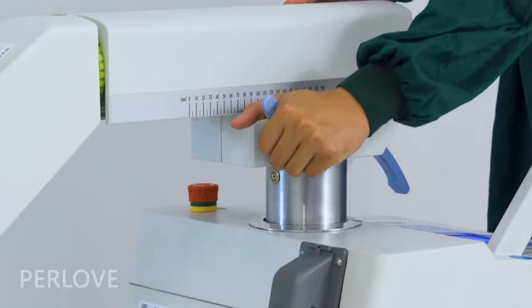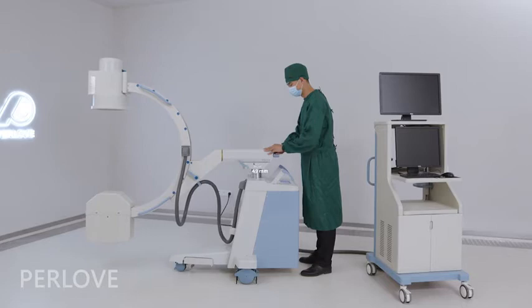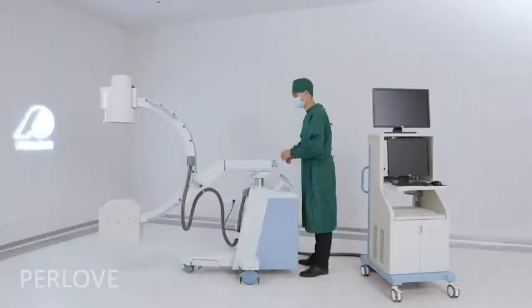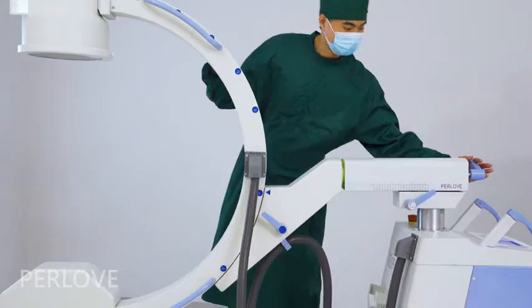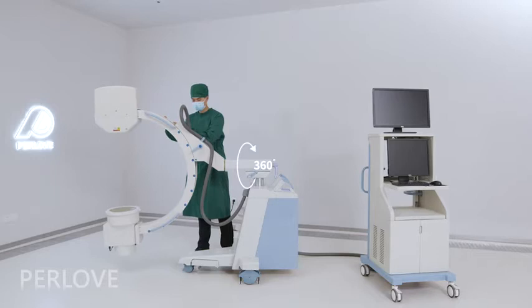This handlebar controls the C-Arm to move forward and backward up to 200mm. The C-Arm can also be rotated around the horizontal axis by plus or minus 180 degrees.